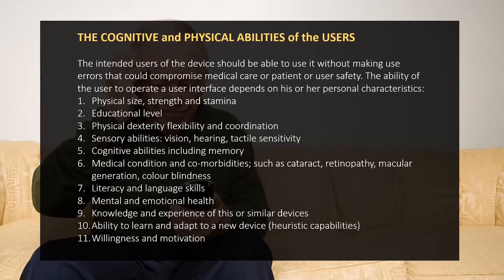Well, you can make lots of assumptions. Therapist, well, again, it's never a single audience. There's always a range of audience of people that have to interact with the device. They could be even maintenance staff. It could be the IT staff, which give you various different levels that you move through with the graphical user interface. But you can make as many assumptions as you like. The whole point of doing this work is to go and observe and actually test. And if it fails, come back, set some new parameters and test again until you find something that is driving towards what you're after, which is reducing risk, increasing clarity, making it easier to use.